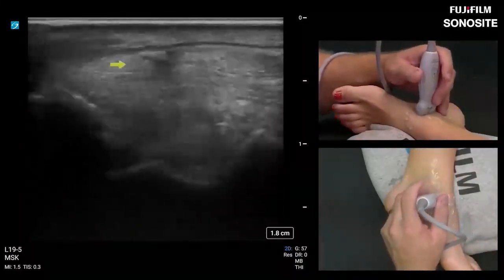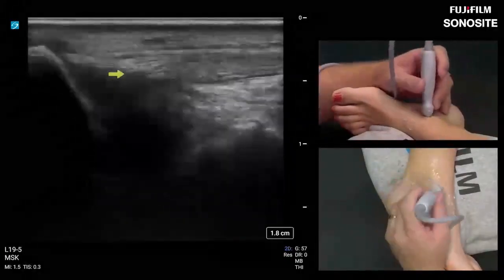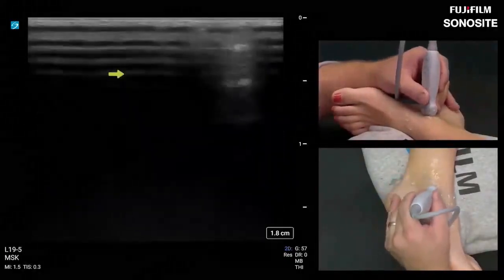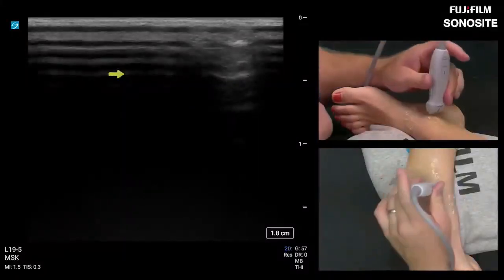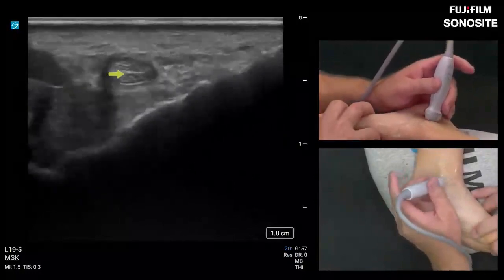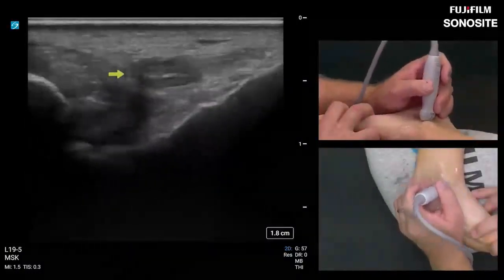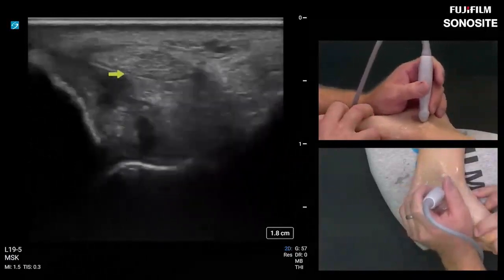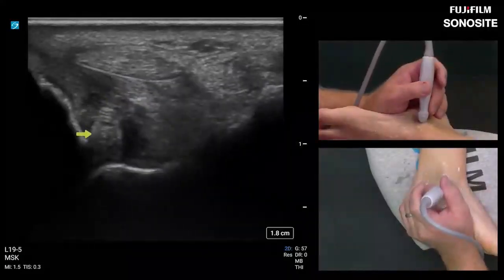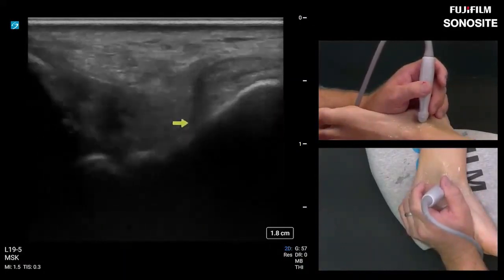And then let's just take a look at these ligaments while we're here with the 19 megahertz, since we didn't do that last. So here was that posterior tibio-talar portion. We're going to dorsiflex the foot and look at those ligaments really nicely. Very high res. I mean, we're seeing so many fibers, this broad area right here, all the way down to the talus at this point.